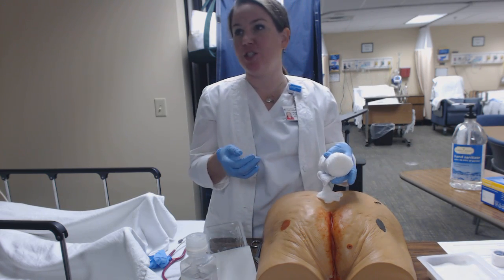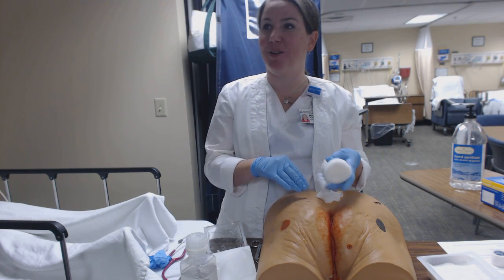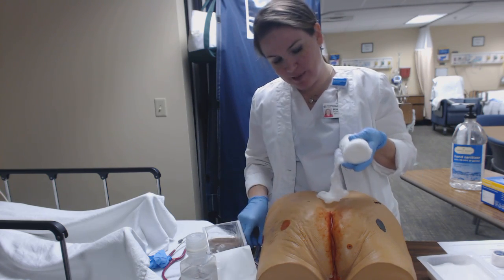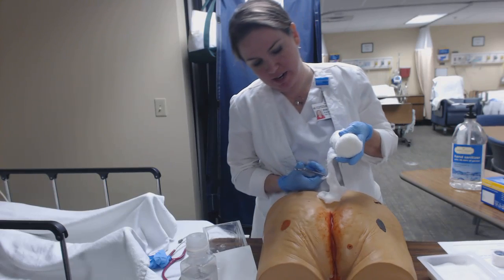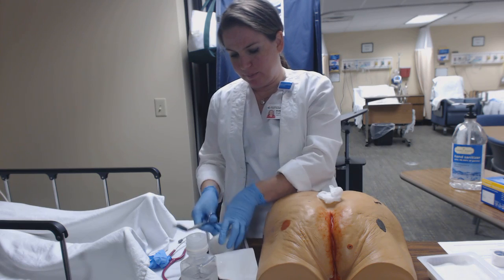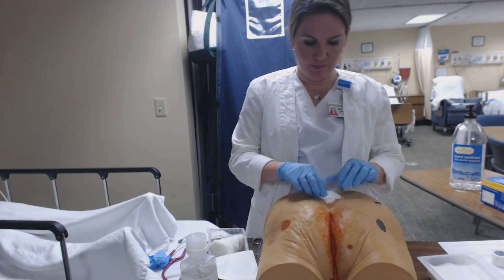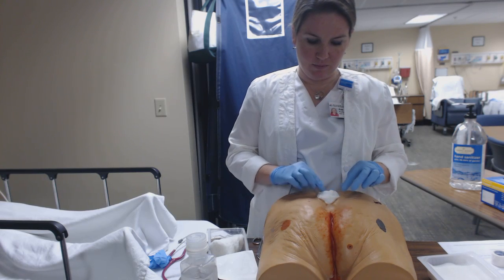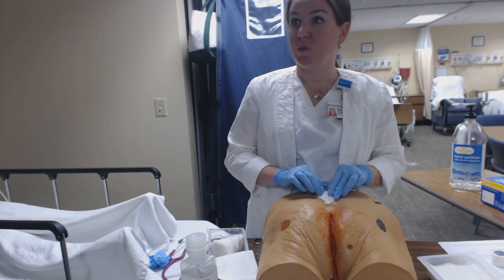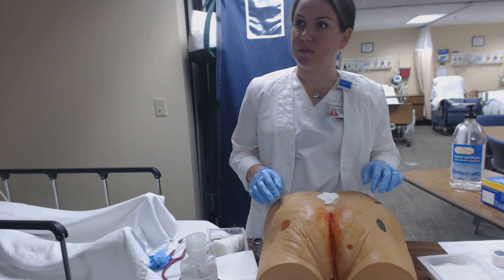So if I'm a nervous student, what do I do here? Do I pull it away to cut it? No. I just want to keep it here, and then we can cut the gauze at the length that we need it. Again, if this was a sterile surgical dressing, like Miss Blackmore's going to show you, you would have to use sterile scissors. That's right. And those scissors are not sterile. So remember, this isn't a sterile wound.